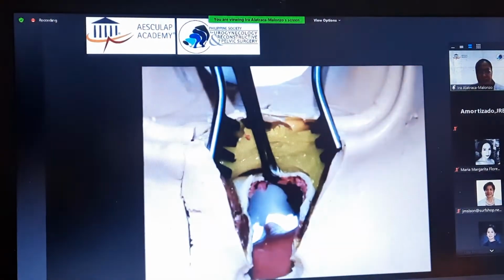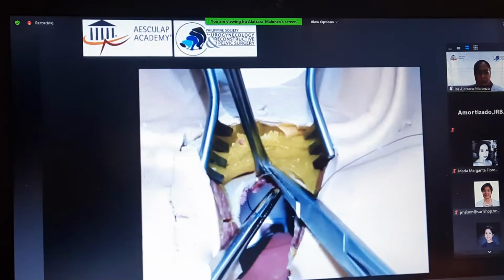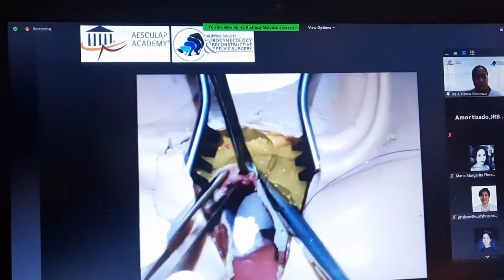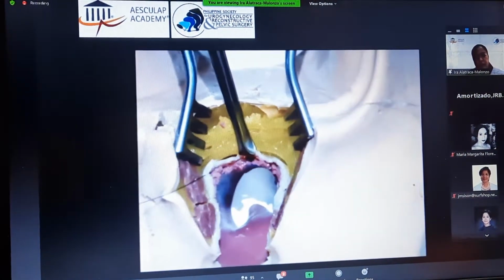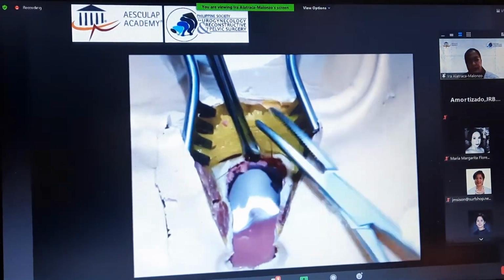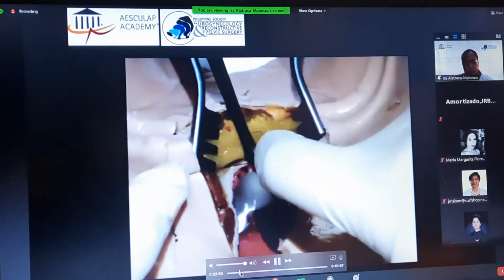Notice the model giving way, but in our actual patient, we need to be able to get enough tissue from 0.5 to 1 centimeter from the edges. Again, no figure of 8 stitches. So again, simple interrupted technique and secure those knots.